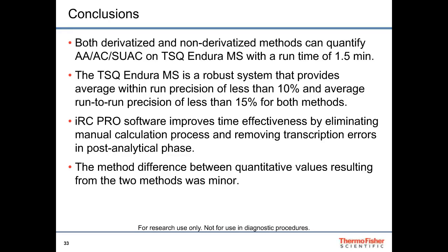Okay. Next question, how can non-derivatization direct injection permit high analytical specificity for complex sample analysis? So derivatization sample preparation does give us basically a little better specificity because it will increase the mass of the analyte.